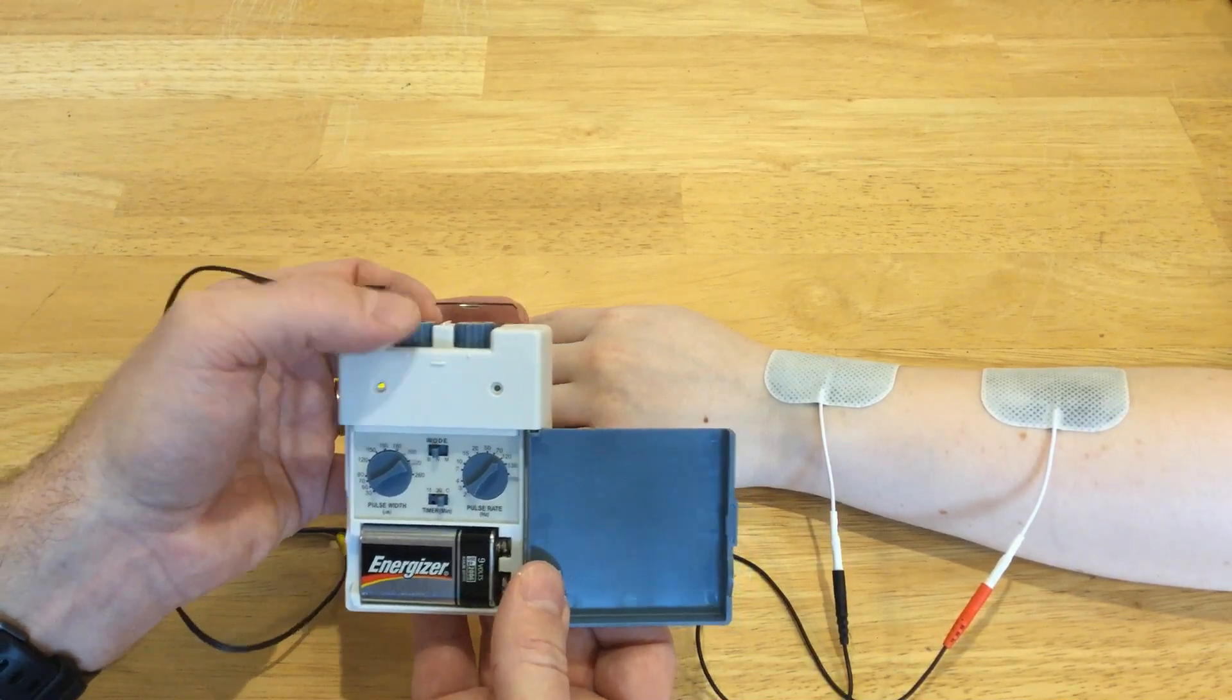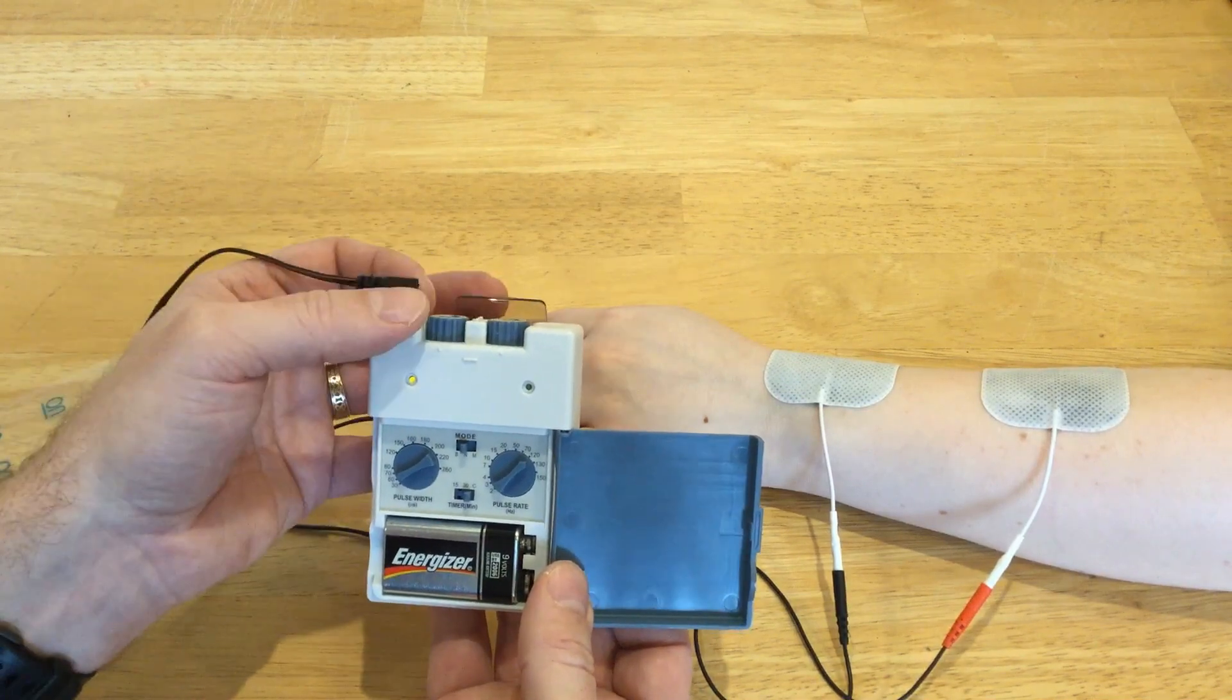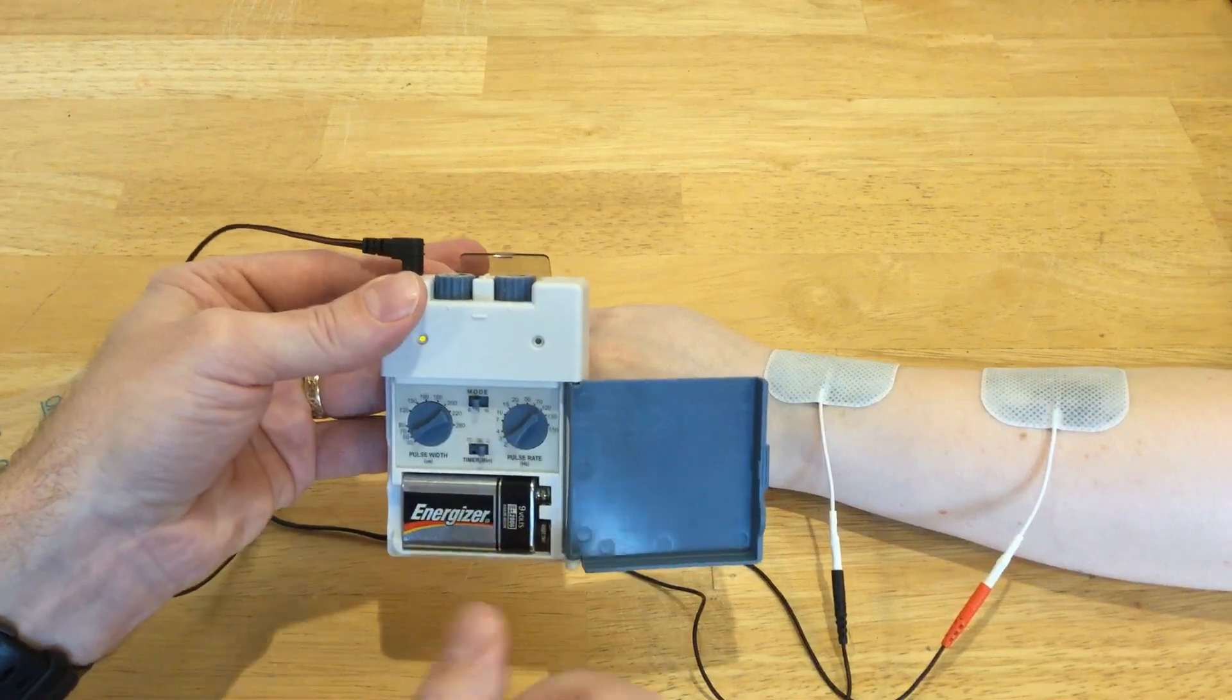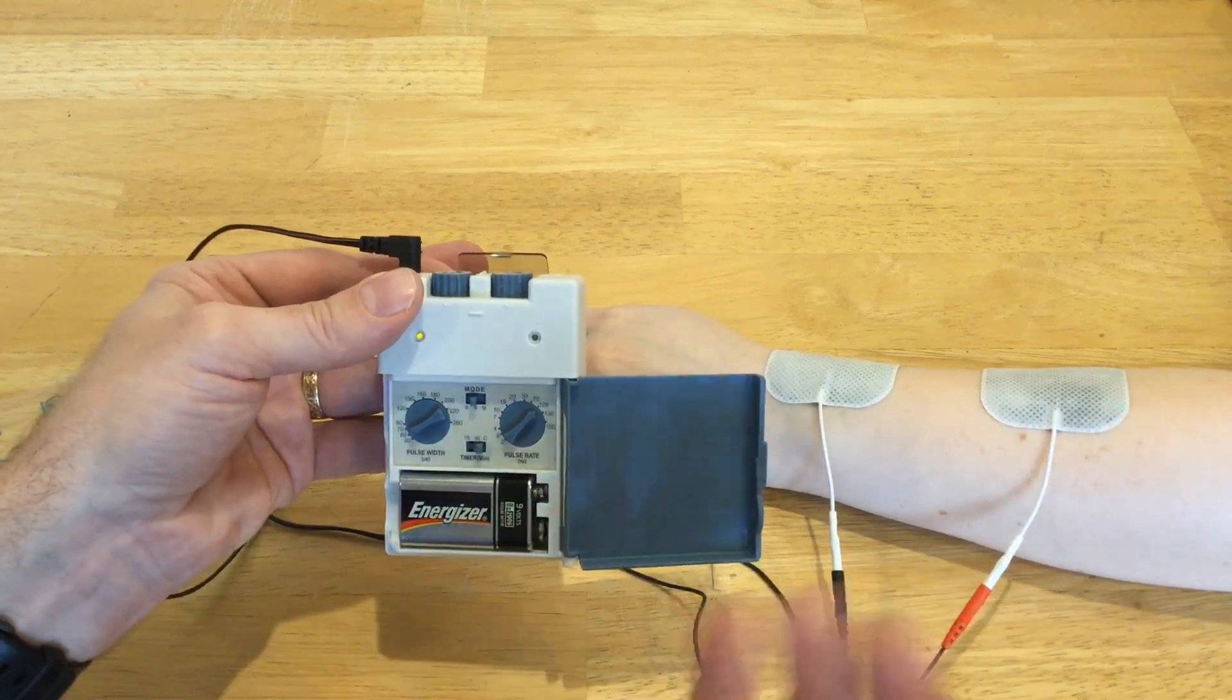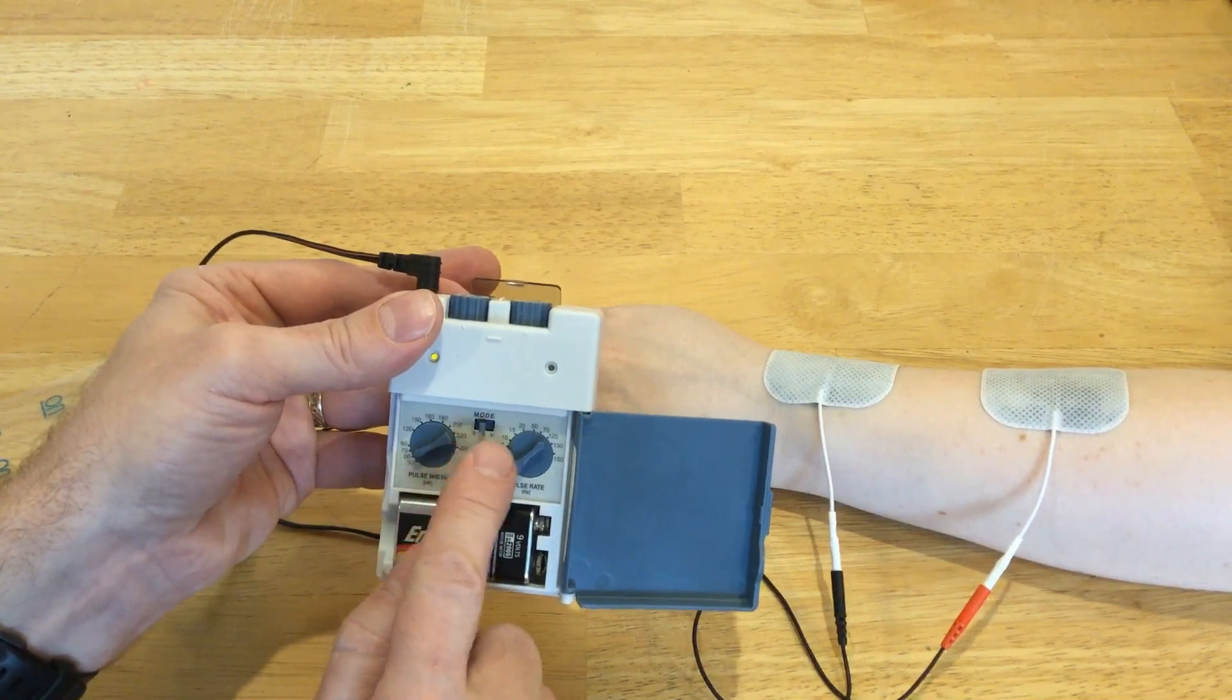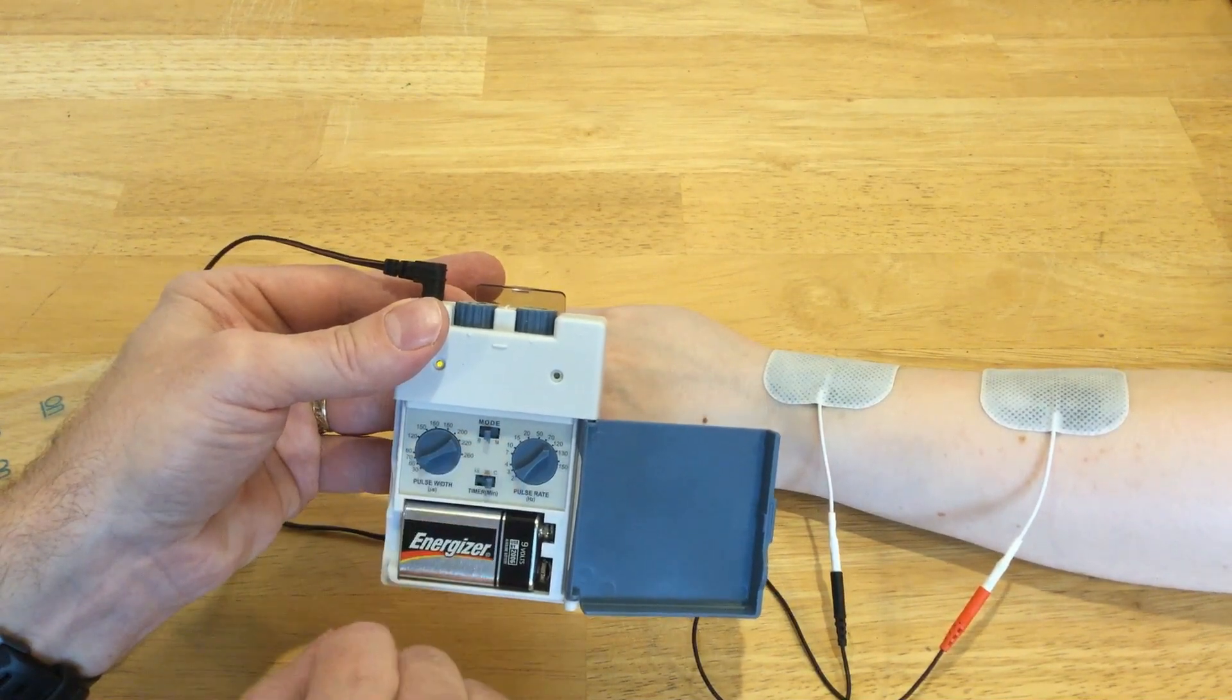And you could turn it up a little higher to get a little more intense tingling, and that would be fine. Once you've got everything set up and your patient says yeah, I feel it, and it feels like it's going through the area of pain, then you can play around with the mode and switch it to modulated or burst.